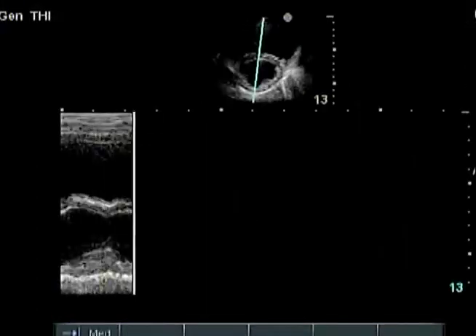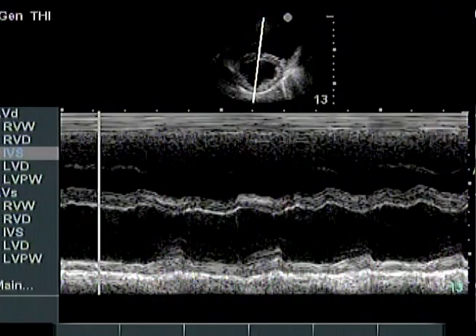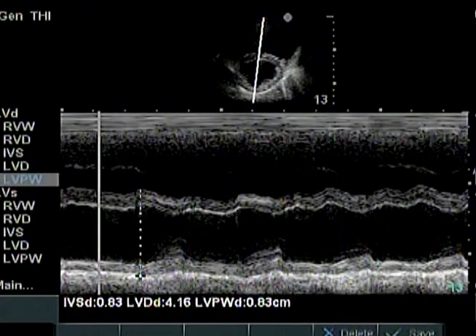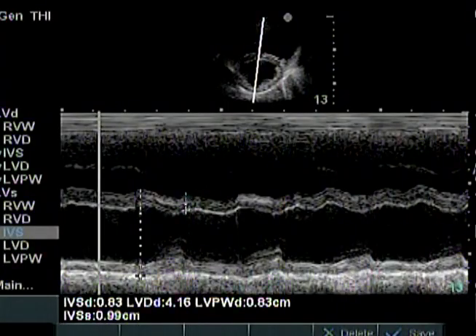This occurs most frequently when right side diastolic pressure exceeds left side pressure with moderate to severe right ventricular volume overload. As left ventricular pressure increases just before systole, there is a sharp upward movement of the septum, right at the point where you normally make diastolic measurements for fractional shortening and ejection fraction. These paradoxic movements of the septum invalidate the fractional shortening and ejection fraction calculations.